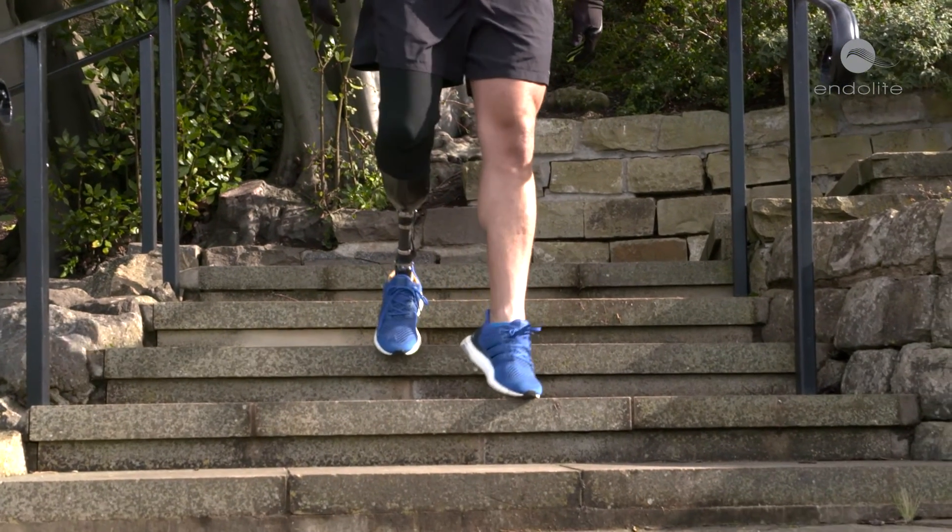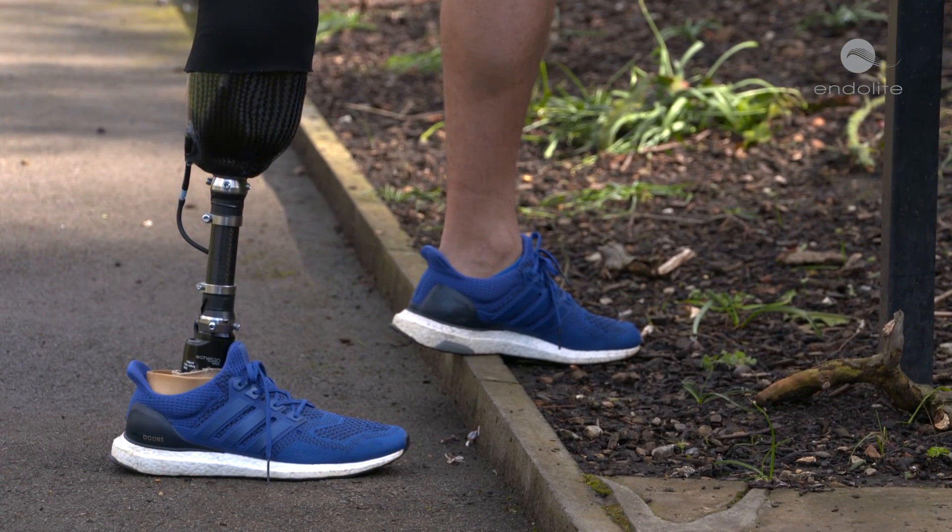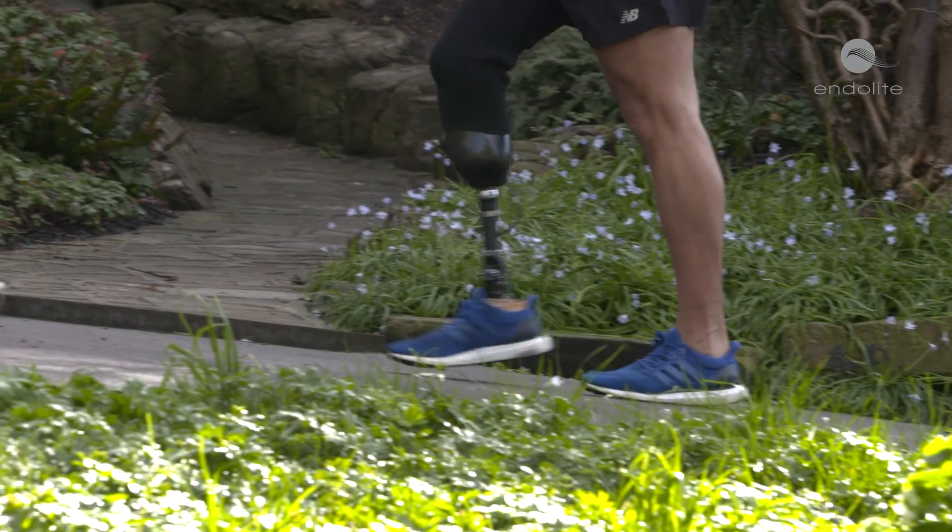The Echelon VAC combines the benefits of an elevated vacuum system with a hydraulic ankle. It's lightweight, has a low build height, doesn't require batteries, and is quick and easy to fit. You get all the advantages of a hydraulic ankle, which reduces stump-socket interface pressures and provides better ground compliance.